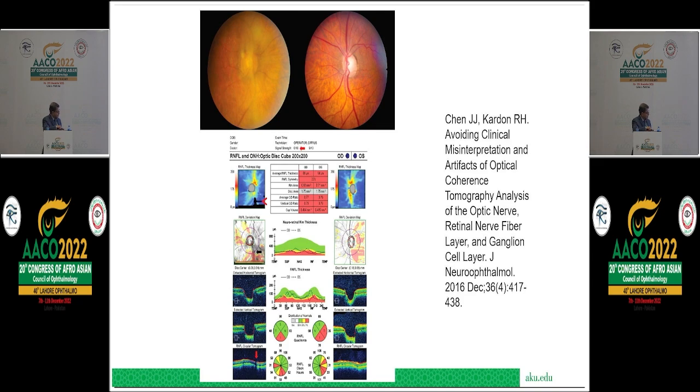So if you look at the segmentation, right there, there's information missing because of this area here, right? If there is something that is not anatomical on the retina and it looks like a rectangle or triangle or something weird, it is probably something in the media, right? Missing information. So this actually happens to be a case of asteroid hyalosis, right?